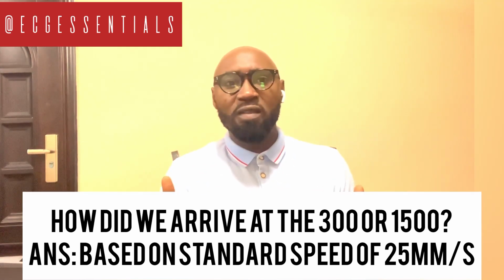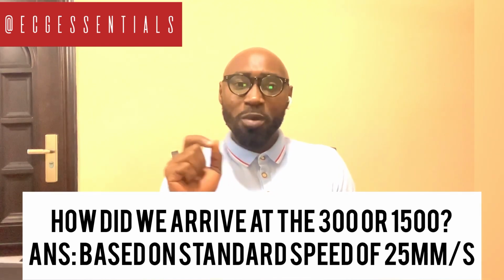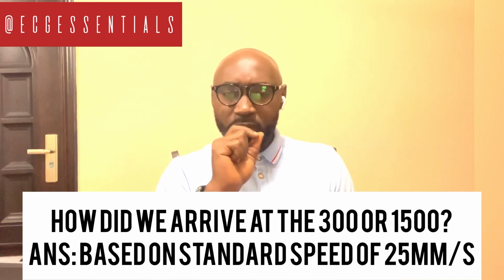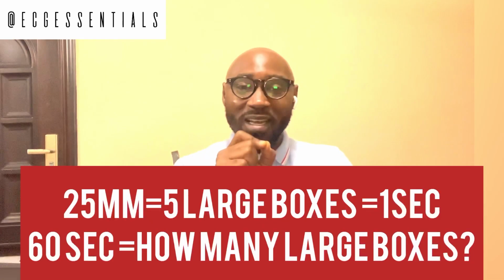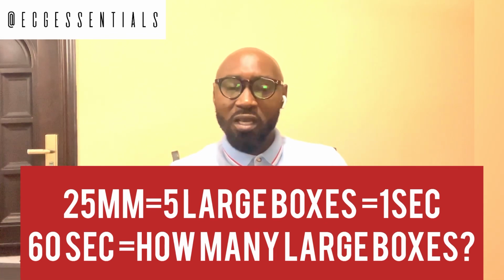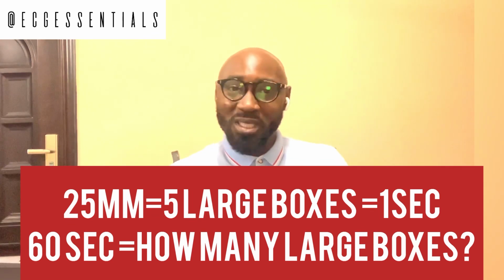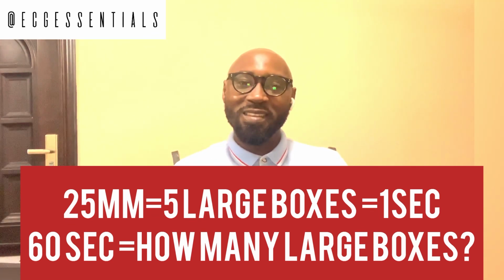We have stated that on the horizontal axis, the standard paper output rate is 25 millimeters per second, and this means that 5 large boxes are actually covered every second. Why? Because each large box measures 5 millimeters.